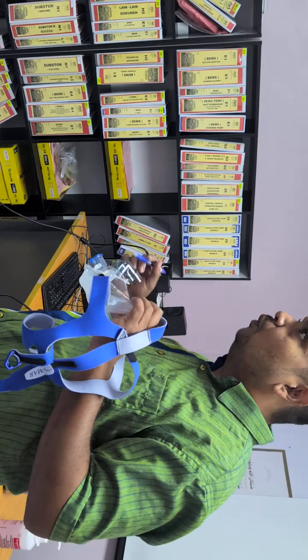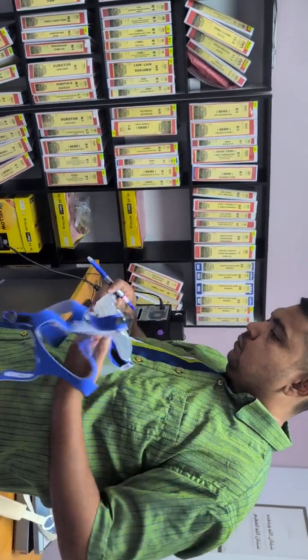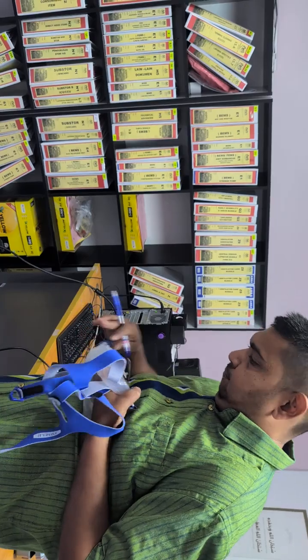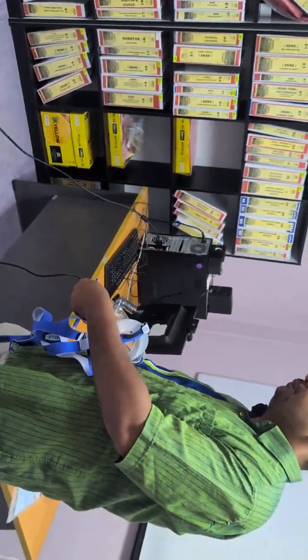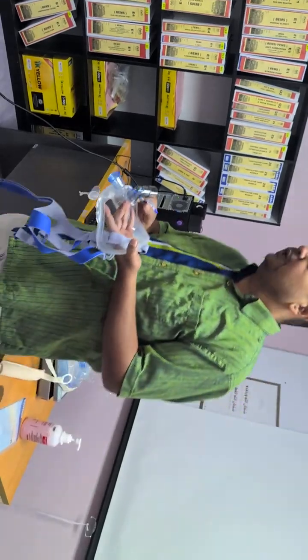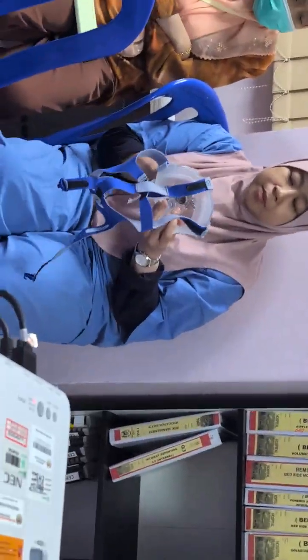ETCO2, whatever other wires are coming, NGT, whatever is coming, here. It has a port. Okay? ETCO2, here. Compatible to any machine. Any machine. NAP can do this. Yes.